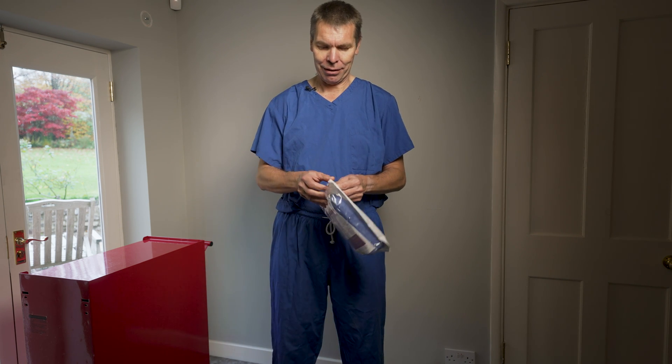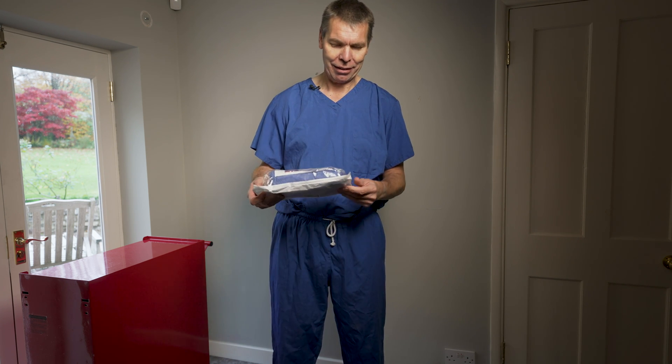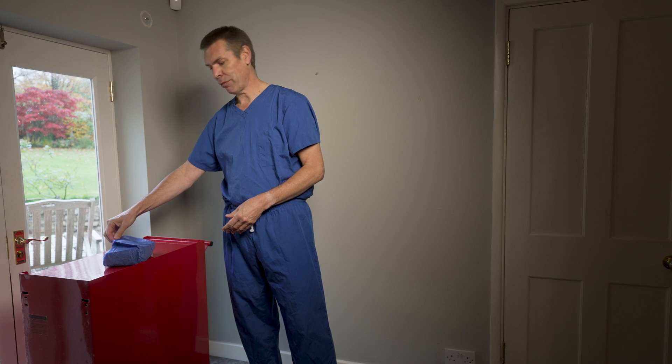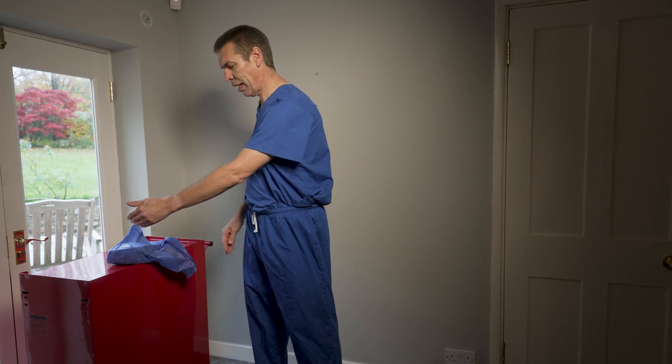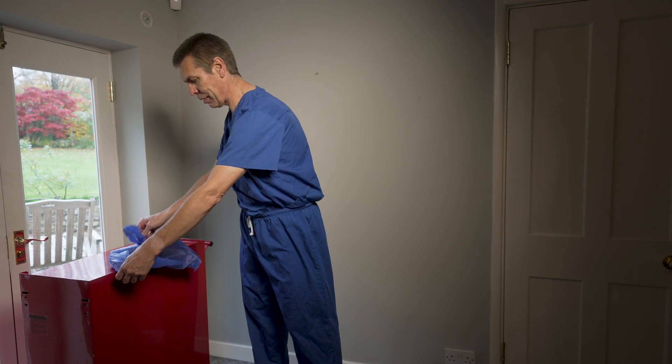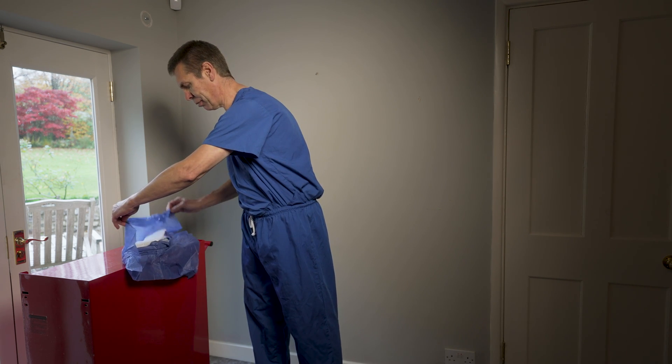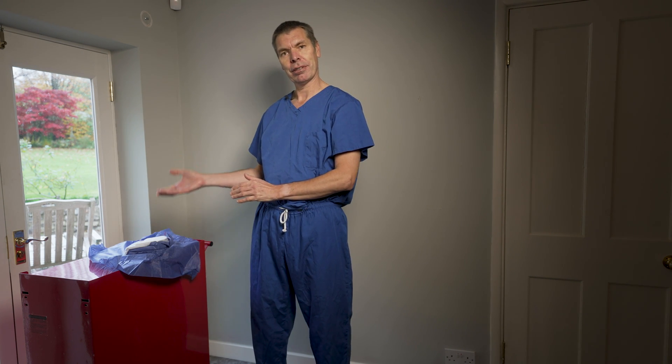This is the disposable gown we're going to use today. It's double-wrapped, meaning there is an outer packet and an inner packet. I'll open the outer packet and discard it. The gown is still sterile within the inner packet, so I place it onto the table. The front flap comes towards me to cover the front of the table, and keeping my hand on the outside of the wrap, I open the rest, keeping the inner package — the gown and hand towels — untouched and sterile. I now go and wash my hands.